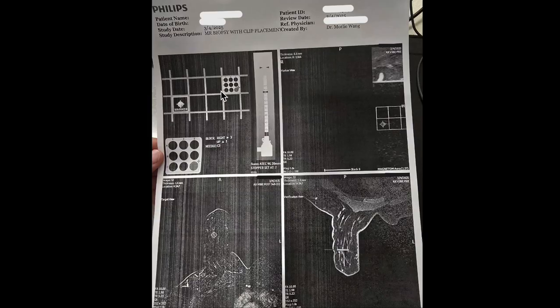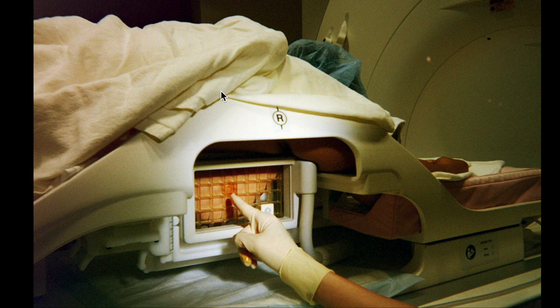Now just remember, this piece of paper is not the patient that I'm going to show you. So for example, this is the correct one for this. I'm doing the right thing for this patient, don't worry, but this patient actually had a different printout. Anyway, so for this patient, this is the square that I am doing.